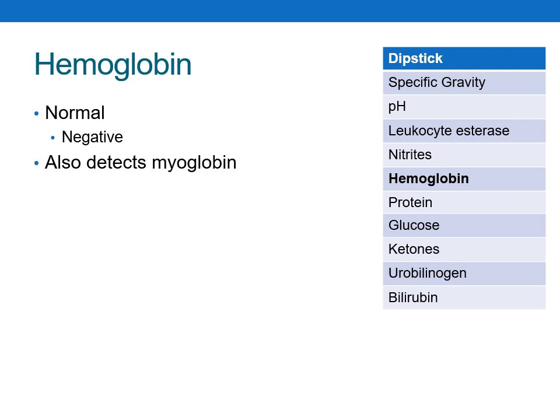Hemoglobin is another item that is not typically found within the urine, so a normal test result would be negative. If it is positive, there are a variety of causes that might have led to hemoglobin being in the urine. These include rhabdomyolysis, a UTI, renal stone, or even trauma to the GU tract. One important thing to note about this test is that it not only tests for hemoglobin but also myoglobin. So the test result will show up as hemoglobin alone, but it is an important consideration that there might just be myoglobin present in the urine and actually no hemoglobin present.